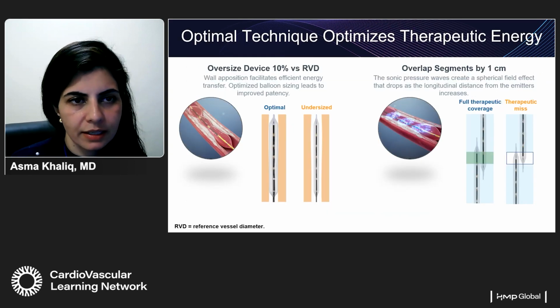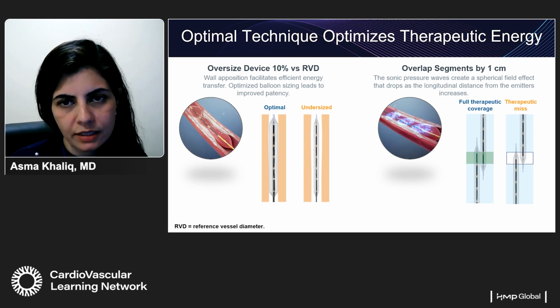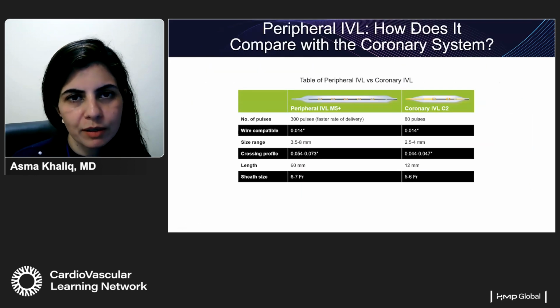And the fact that it has to be at least 10% oversized rather than undersized so that it makes optimal contact, and there has to be a 1 centimeter overlapping segment. I think we talked about this. I would not belabor this anymore.